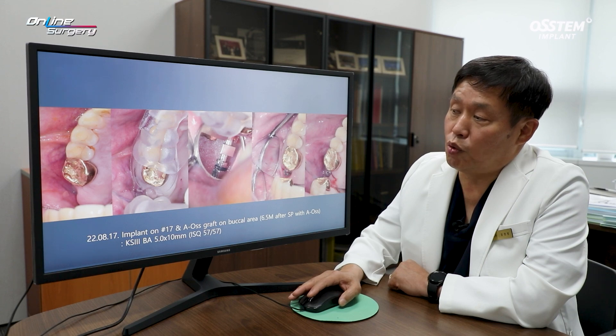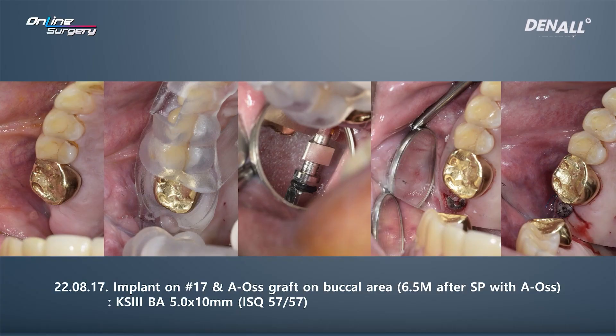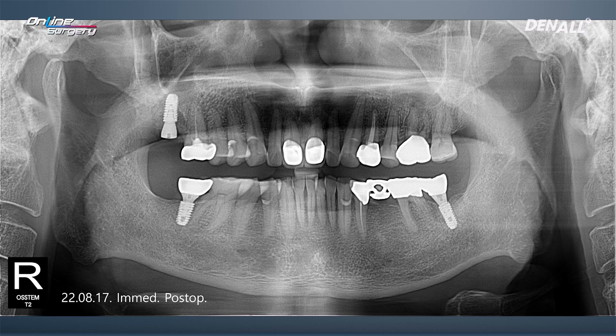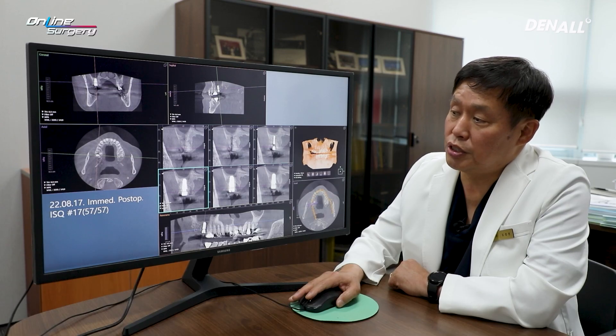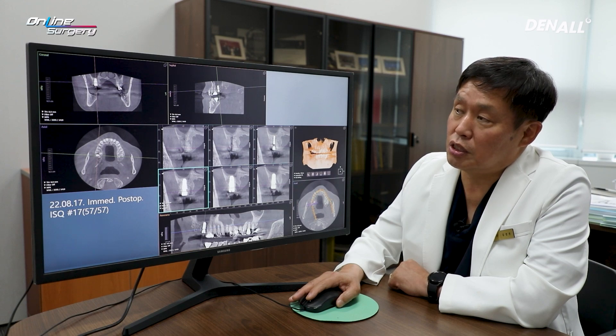As you can see, One Guide was adapted as shown and the implant was placed. The plan was to place the implant slightly deeply and do additional bone graft on the buccal side. Right after placement, an incision was made and additional AOS graft was performed, followed by suture. This is the immediate post-op. The ISQ value was 57/57. On the CT image, you can see that along with the implant, additional bone graft materials were placed in the buccal area.